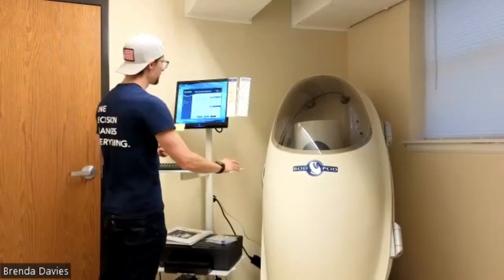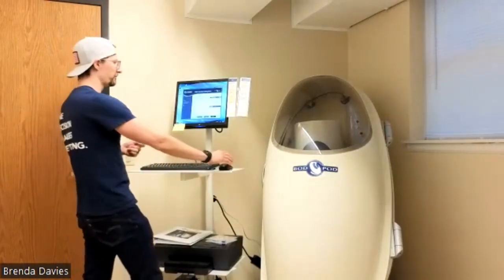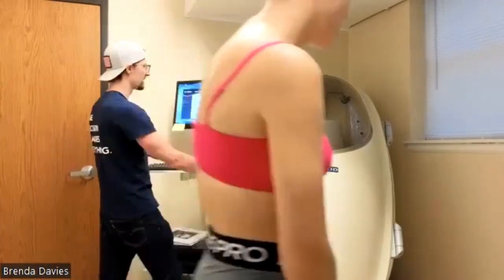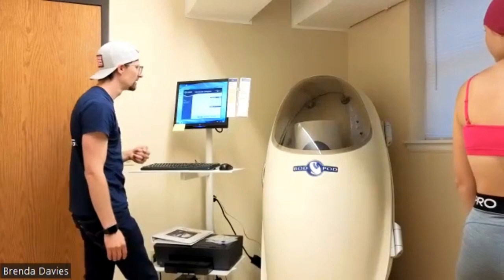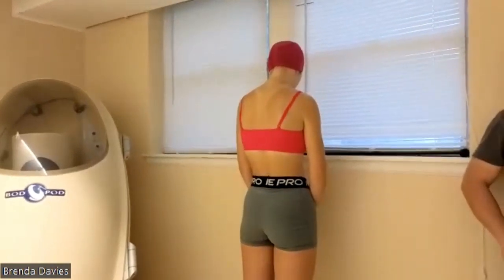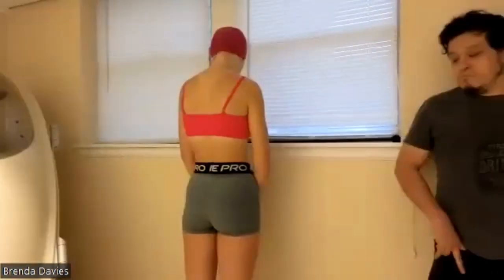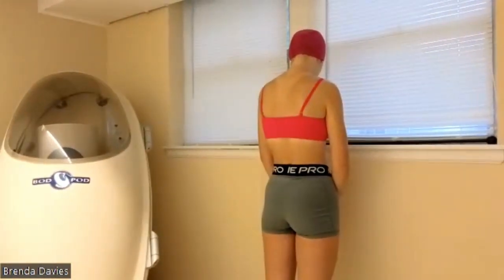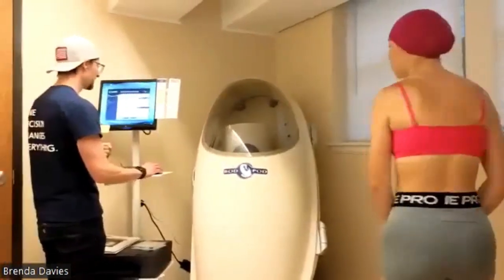So we're gonna have you then step up towards the scale. I'm gonna clear the scale first, making sure the scale has nothing on it. I'll tell you when to go up. Okay, go ahead and step on up to the scale and then hold as steady as you possibly can for about 5 seconds. Okay, step up the scale. Maybe more like 8 seconds.